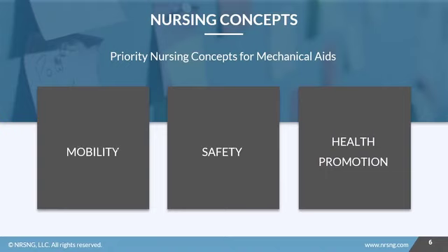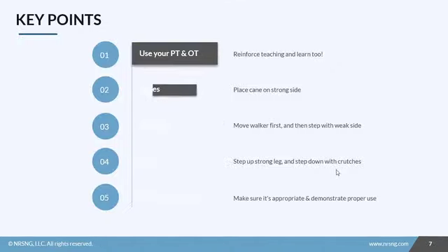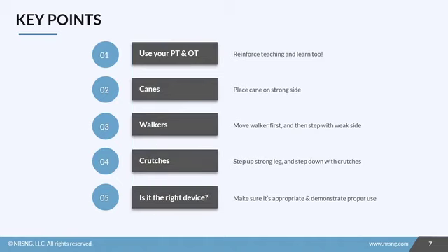In this lesson, we're really focused on mobility and definitely safety for our patients when they're using the mechanical aids. And we also focused on health promotion as well. So let's recap. When using your mechanical aids, make sure that you use physical therapy and occupational therapy to reinforce your teaching, and also use it as an opportunity to learn for yourself as well.